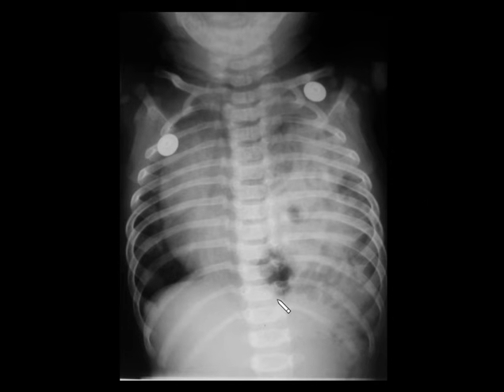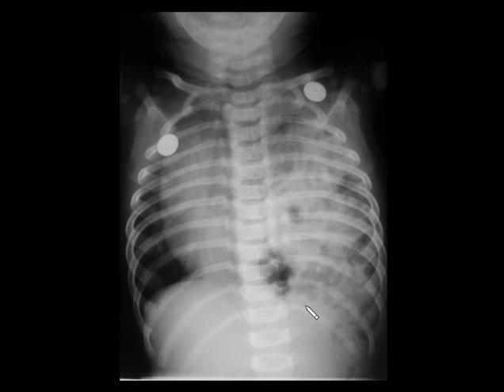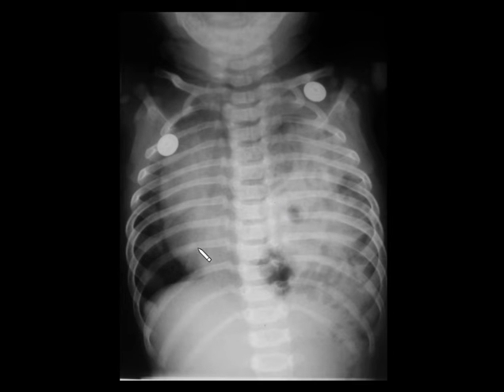Here you can see this radiograph where there is loss of visualization of the left dome of diaphragm, herniation of the bowel loops from the abdomen into the thorax, and significant shift of the mediastinum to the right side. This is a classical case of congenital diaphragmatic hernia.